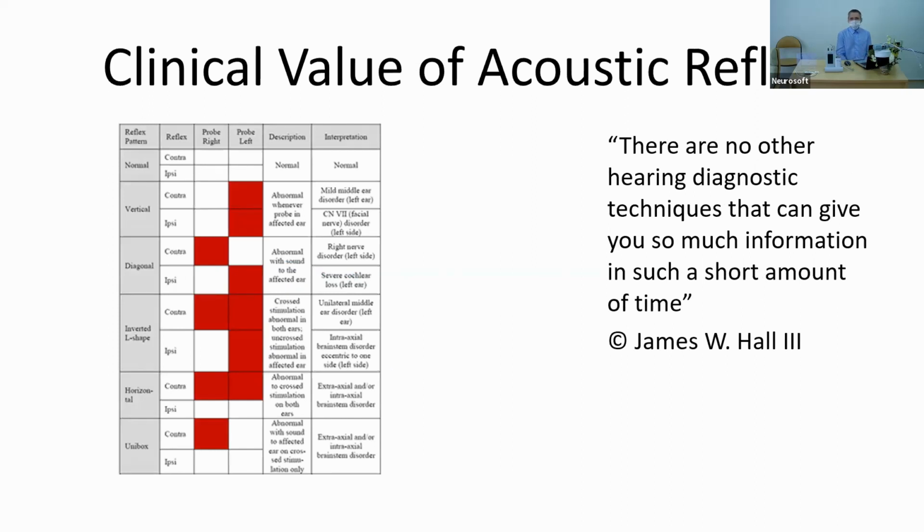So the clinical value of the acoustic reflex is that, first of all, there are no other hearing diagnostic techniques that can give you so much information in such a short amount of time. This is a quote from James Hall, one of the experts for this test and for audiology in general.